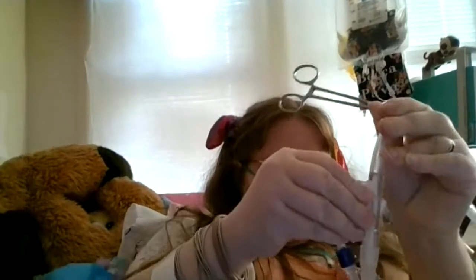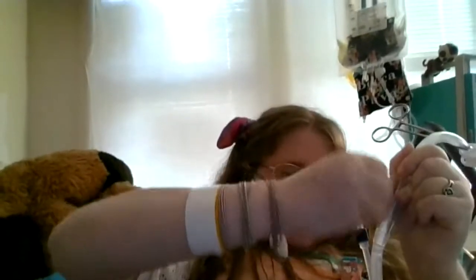The first thing I'm going to do is alcohol prep the site - right here - really well all around. Then I'm not going to touch it with my hands at all. I'm going to have my caregiver open the syringes so I can get the urine out, because right now I have a PCA with me, not a nurse, and she can't actually draw it.